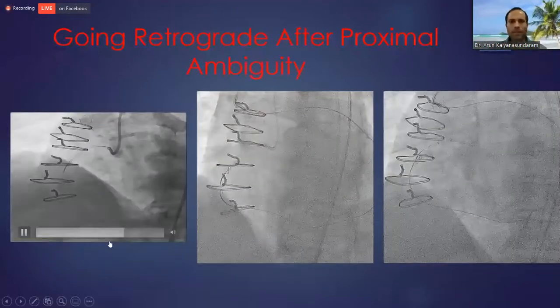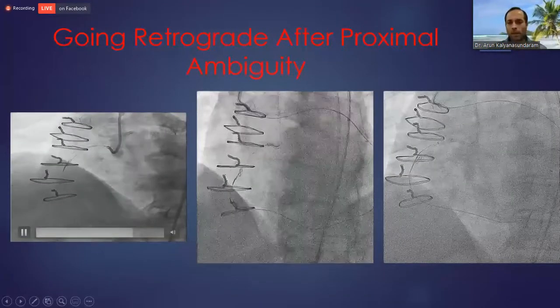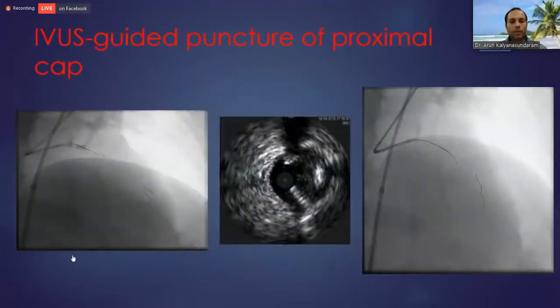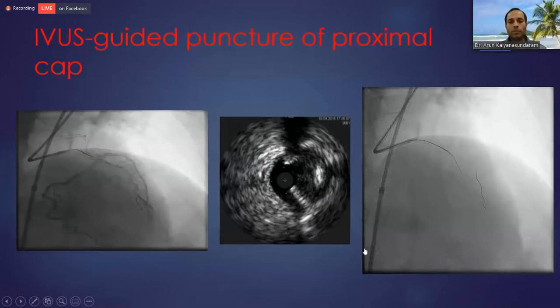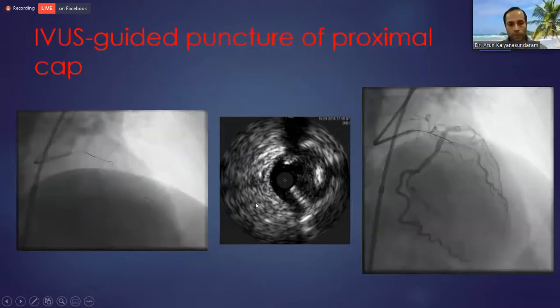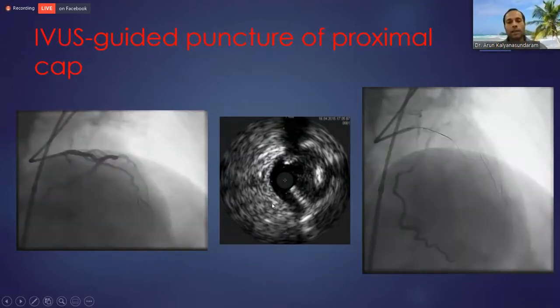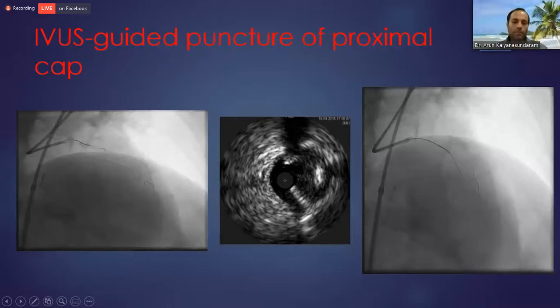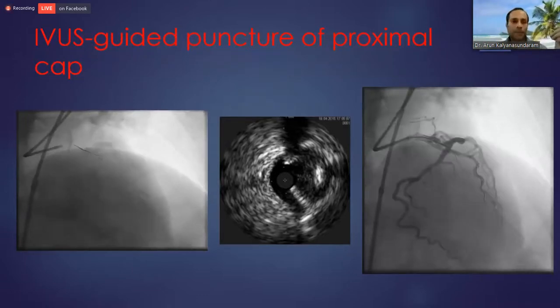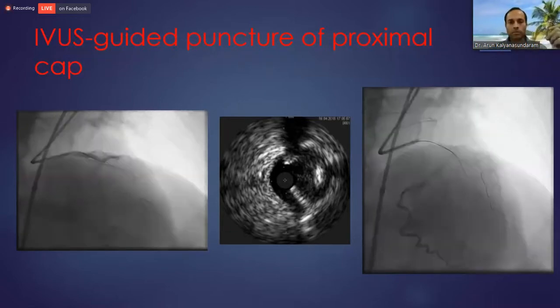In the interest of time and keeping brevity, I'm going to skip it. We all know how to go retrograde. IVUS for the proximal cap, again, I think if you're going to do CTOs, you really should know how to use IVUS and other imaging modalities. So the key is put your IVUS catheter, a short-tip catheter often is very useful for this. It can help identify the proximal cap, then penetrate. Many times you do use a dual lumen catheter for this, and I'll show you a case of this very shortly.